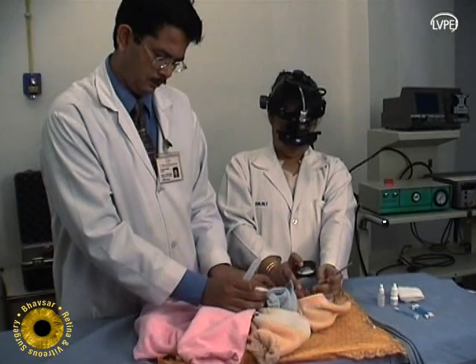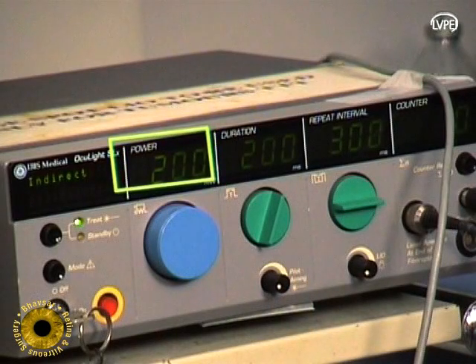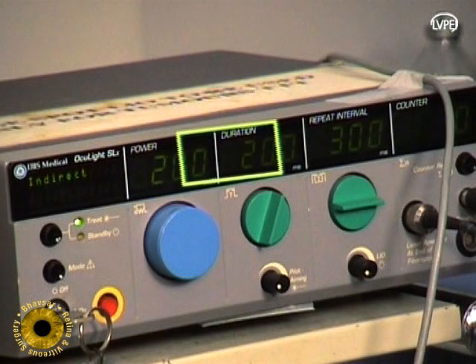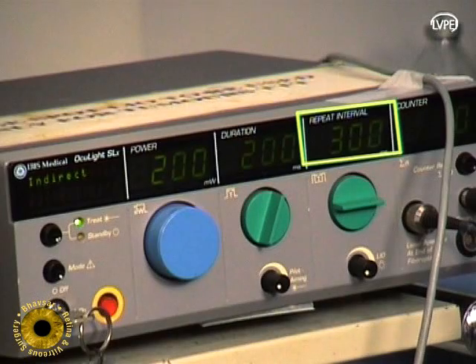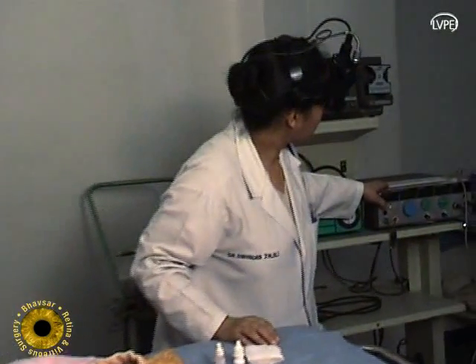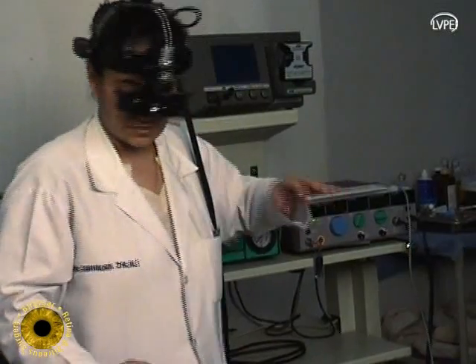We prefer to use the indirect ophthalmoscope delivery of diode laser of 810 nanometers; however, a 532 nm green double-frequency laser can also be used. In most cases, the initial laser settings on the console are 200 milliwatt power, 200 milliseconds duration, and 300 milliseconds for repeat interval.